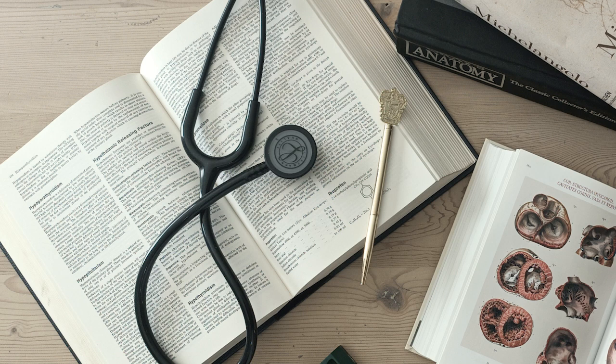Scary. And how about pathological sinus bradycardia? It also involves a slow heart rate, but the ECG looks a bit different. How do we distinguish it from, say, an athlete's physiological bradycardia? Good question. In pathological sinus bradycardia, the key feature is an extremely slow heart rate, often below 60 BPM. But unlike sinus arrest, P waves are present with every QRS complex, and the P waves themselves are occurring at that very slow rate. Okay, P waves are there, just slow.